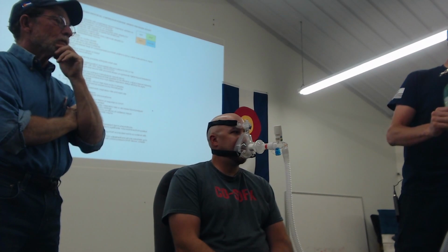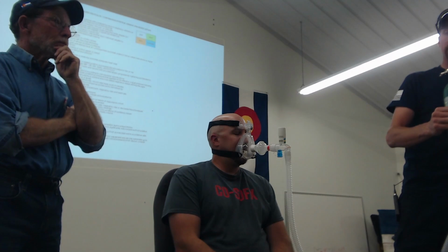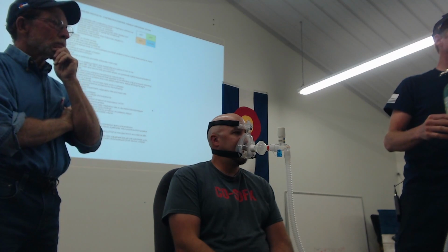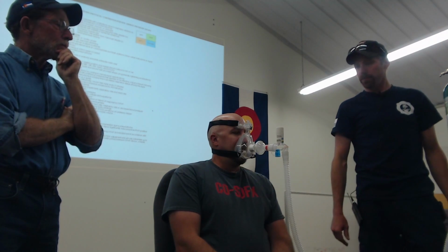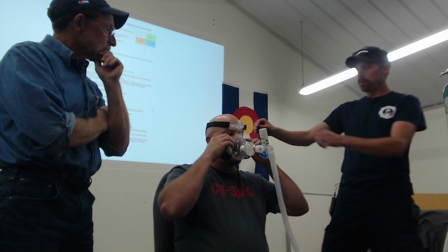You do want to keep this open because if you guys can hear, this is definitely sucking a lot of air in. So make sure that this area stays clear. And you can see that orange valve is closed. Tighter up here.